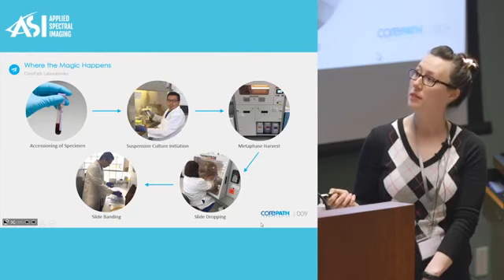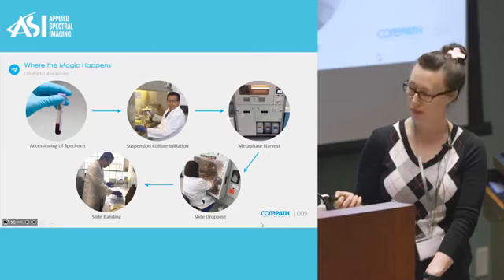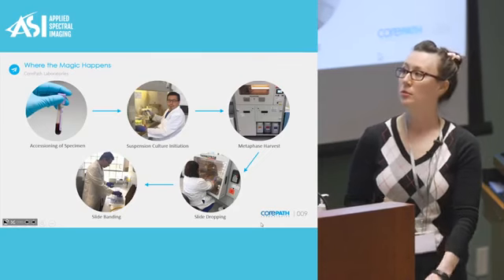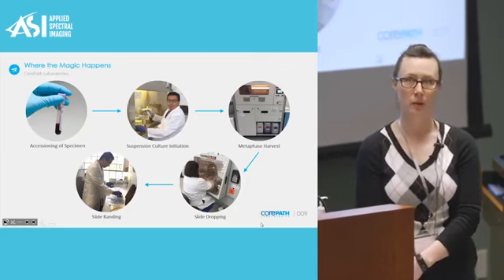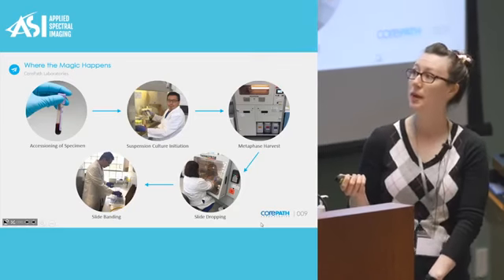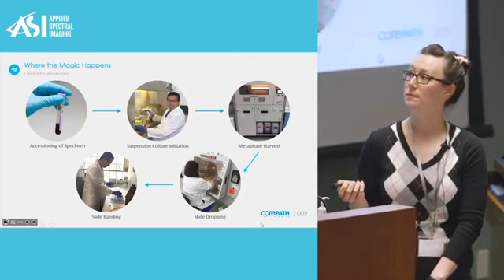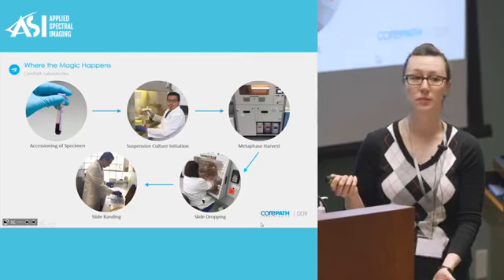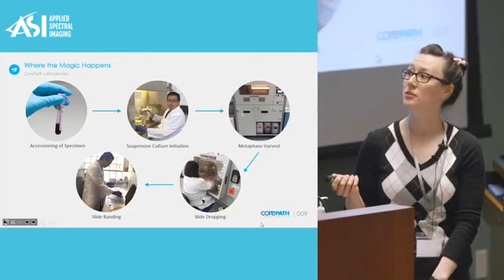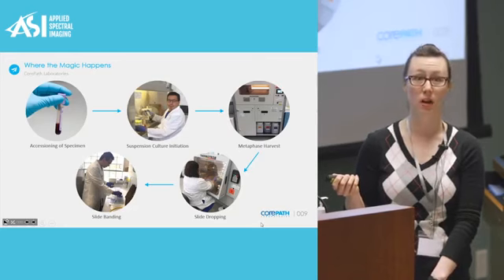Here we can see Bo. He is in the process of initiating our suspension cultures. In our laboratory, we do overnight cultures in addition to stimulated cultures, and we'll unpack that a little bit more later, depending on what is needed. Next, we're going to take our cultures after they've been incubated and put them into our Hanabi P2 automated harvester.